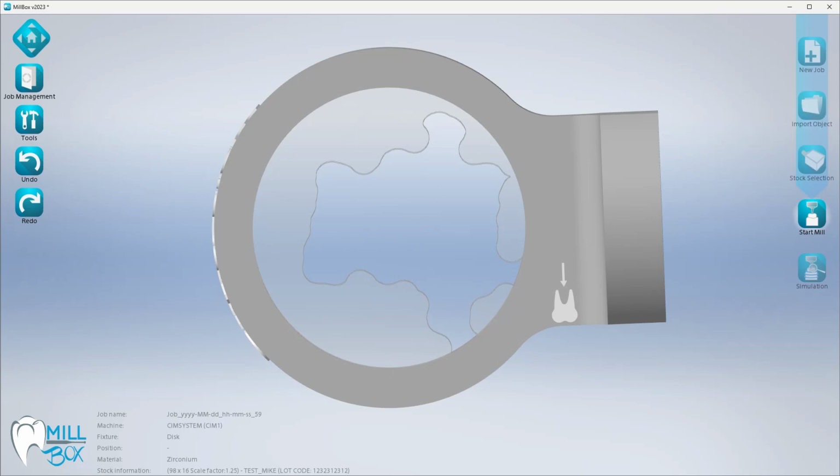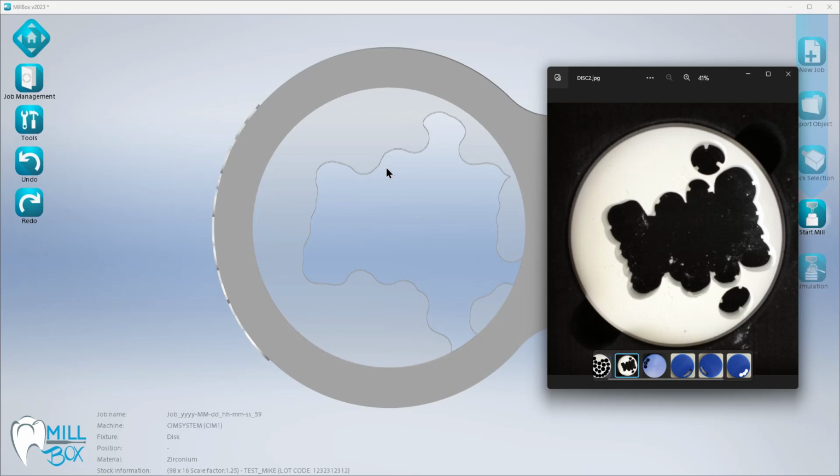Of course, you do want to provide a little bit of a buffer, so you can see that these curves are not exact. You know, it's not able to see some tiny slivers of material in between here. So you do need to give yourself a little bit of space, but ultimately this is much better than having to kind of hold your disk up to the monitor and go through all that trouble.